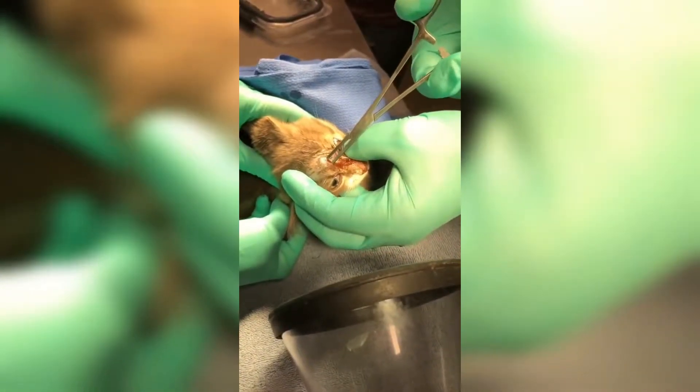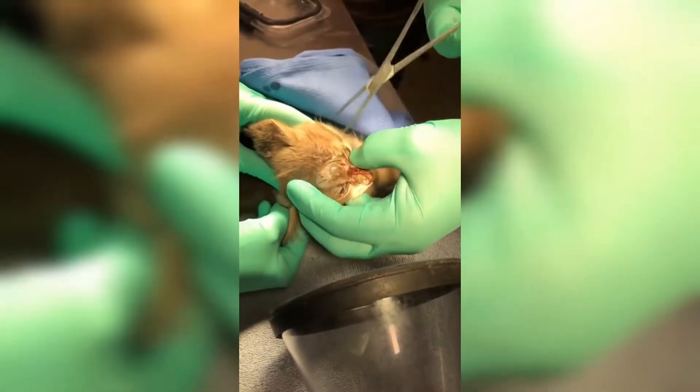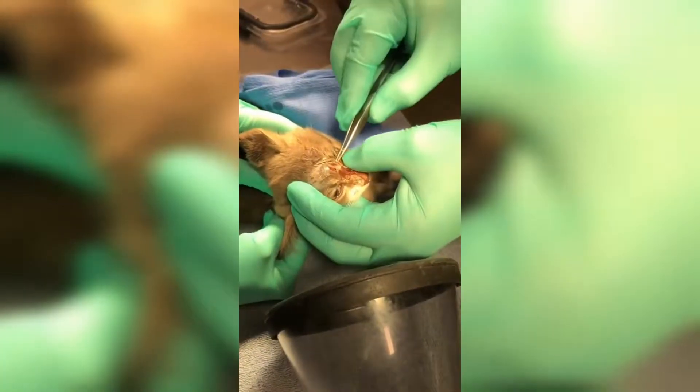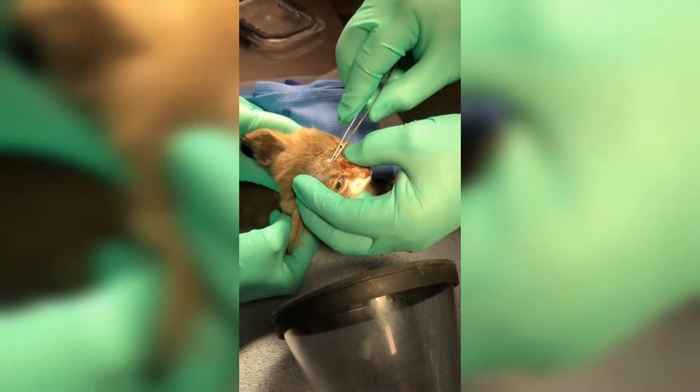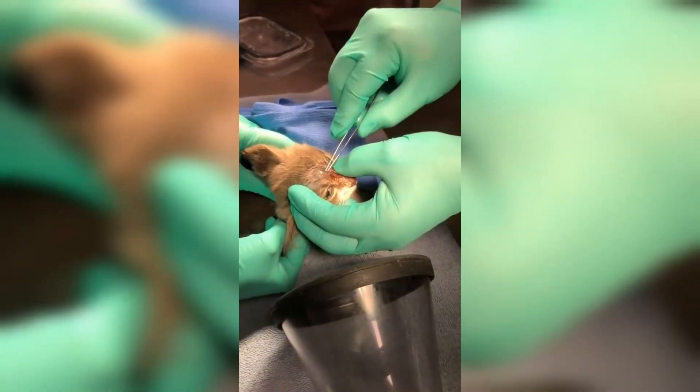Hello everyone on the channel Helping Pets. In this video, you will see Cuterebral larva removal. For those who don't know, these larvae are placed by flies in wounds, and yes, they can be placed in humans too.